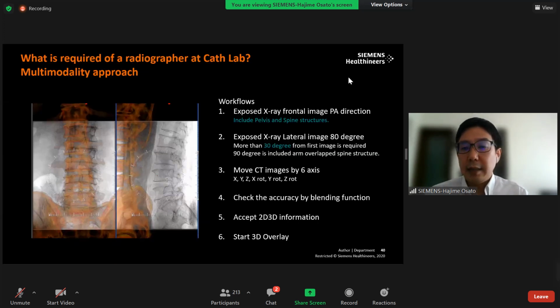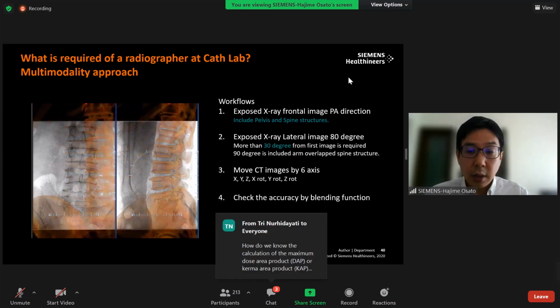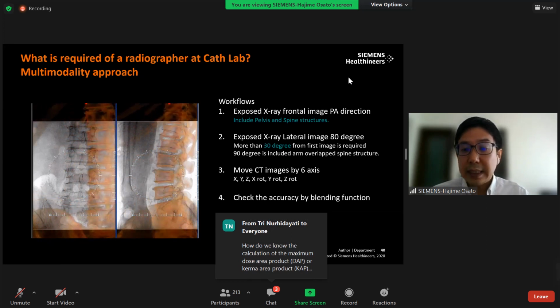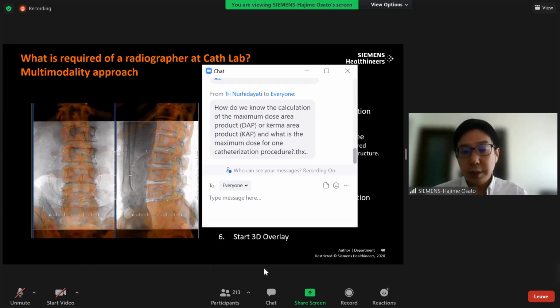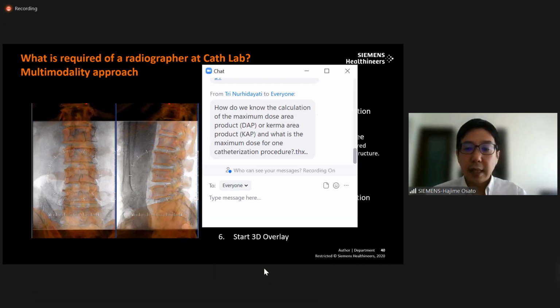And one more technique is 2D, 3D fusion. This uses fluoroscopy from two directions for the fusion step instead of a 3D volume image, especially for aorta procedures like stent graft and dissection and so on.